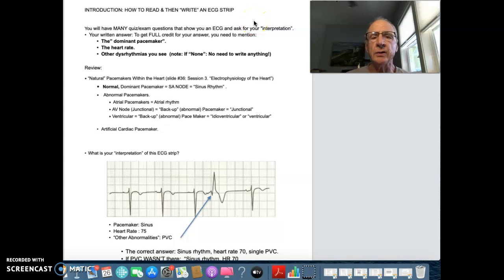I am your instructor, and this is the first of a series of short videos that we're going to go over to help you with how we write the description of what we see on an ECG strip. This is just an introduction.